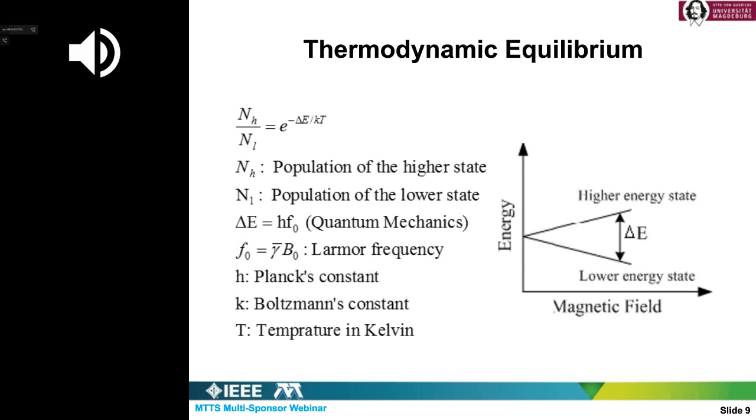This ratio becomes less as we decrease the temperature. And this is actually better for us, because if it is less, we have more lower energy than higher energy particles, so that the difference itself becomes larger. Delta E itself is proportional to the applied magnetic field, as we saw in the last viewgraph, so if you would like to increase this difference, which means decreasing this ratio, you have to increase the applied magnetic field.